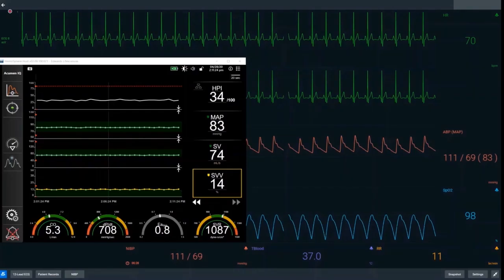We join our simulation approximately 20 minutes following induction of anaesthesia. Before we start, we'll orientate ourselves to what we see on the screen. In the background, we have our basic patient monitor with our continuous ECG at the top, currently at 70 beats per minute.